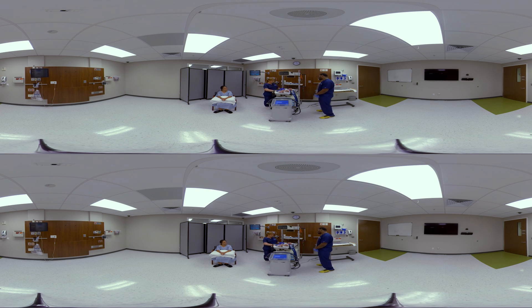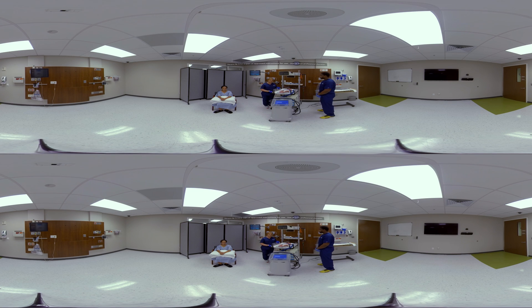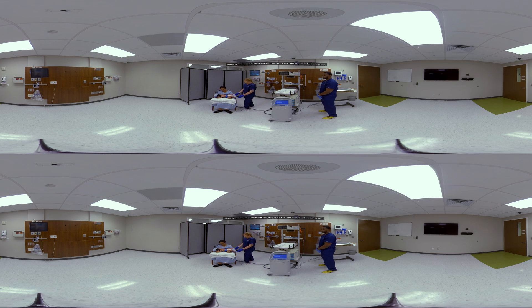If you would like to use positioning devices, you can do so on the outside of the pad. When delivering therapy with the Arctic Sun 5000, you can position the neonate as you normally would during your regular care. If appropriate, you can have the mother hold the neonate throughout therapy. Make sure the mother is seated in a comfortable position near the bed, and we can transfer the patient into her arms. We'll just want to ensure that the pad stays placed in between the mother and the neonate in order to prevent any heat transfer between the mom and the patient.